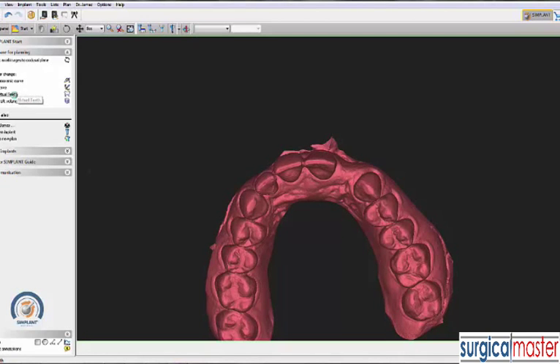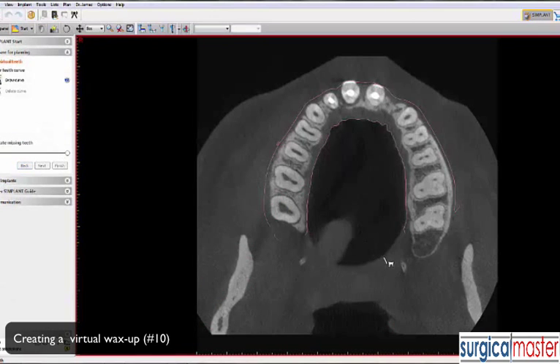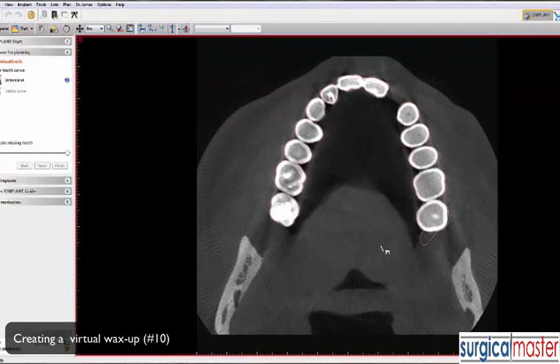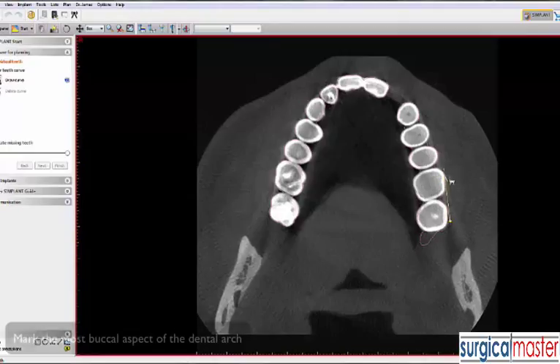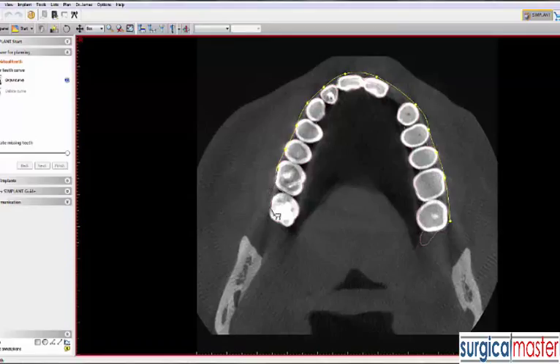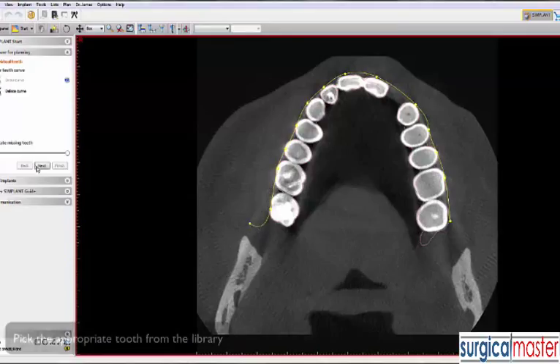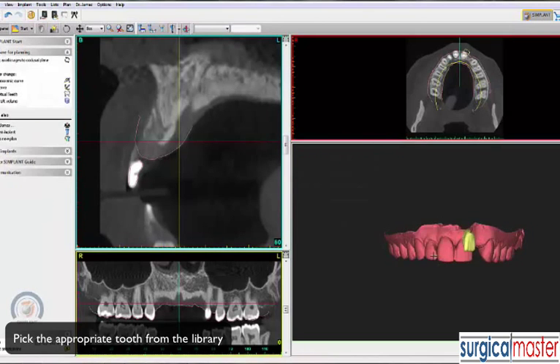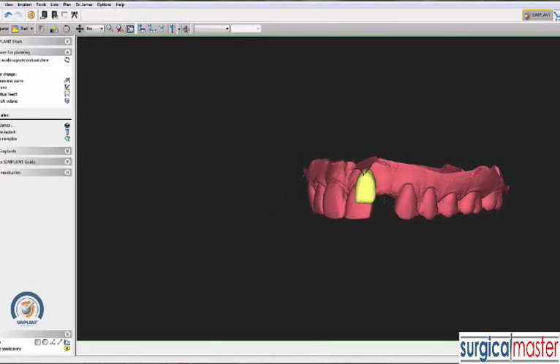The first thing we need to do is create a virtual tooth — a virtual number 10. The software asks us to mark the most buccal aspect of the existing teeth so it can create the right tooth almost in the right position. We create a little arch here, choose the number 10 tooth, and it roughly places it in position. We need to make some adjustments, as the tooth doesn't quite fit there yet.